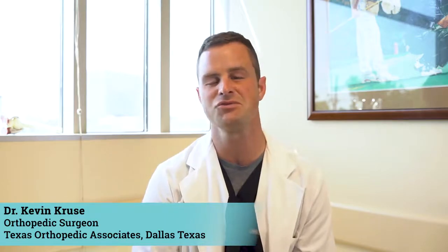Here today talking to you about shoulder surgery and some of the reasons why we use the devices and implants that we use in shoulder surgery. So if you've made the decision to have your shoulder replaced because of severe pain due to arthritis or a rotator cuff tear, the next step we talk about is replacing the shoulder. And again, we've talked about there's two types of shoulder replacements.